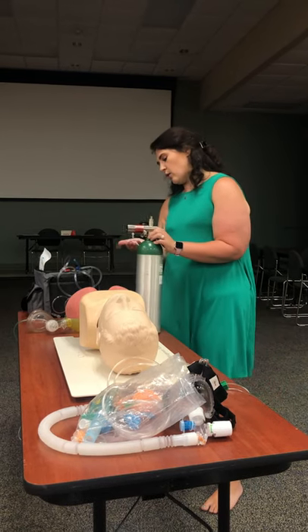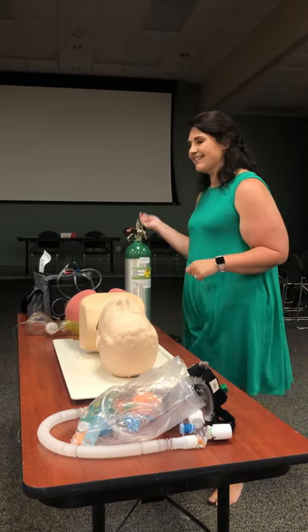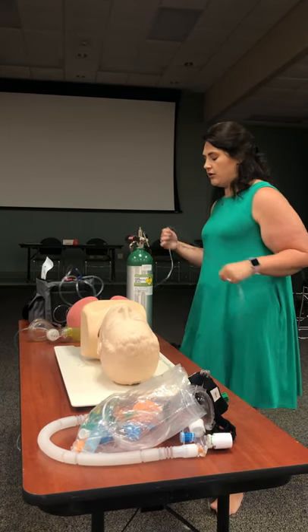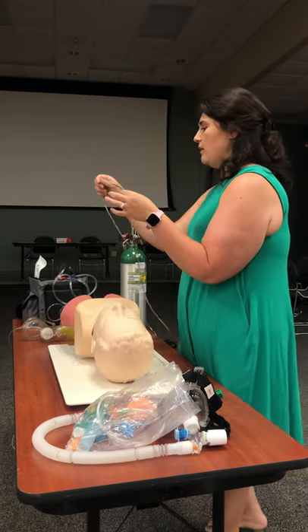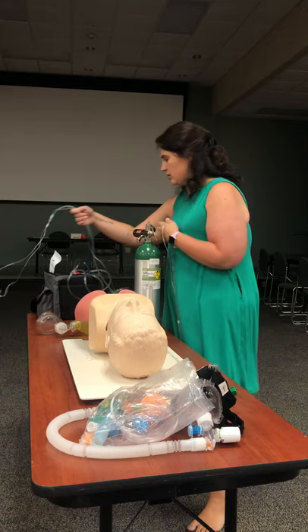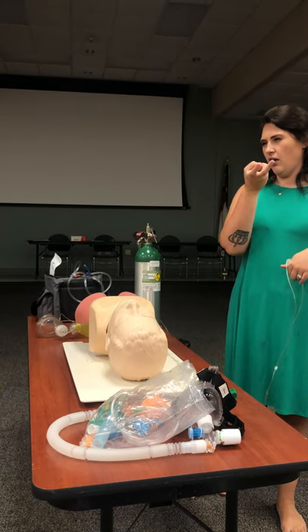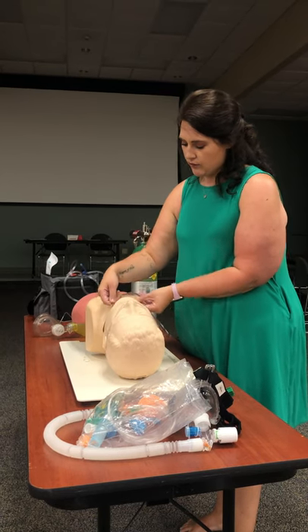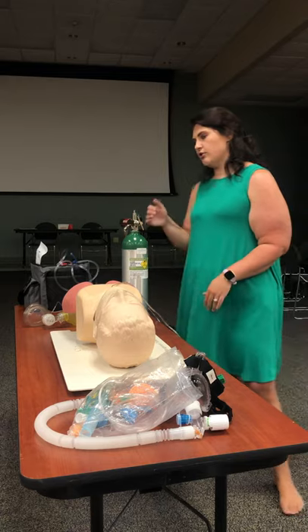I'll attach my oxygen tubing here. For the nasal cannula I'll set it between one and six liters per minute — normally two to four liters. I hook it up and turn it to two liters. I tell the patient, 'I'm going to put this oxygen in your nose; it's going to tickle a little bit.' The prongs go directly into the nose from the front — if they're bent, you want them curving down into the nose. I wrap the tubing around his ears and tighten it up underneath his chin, then monitor the patient and oxygen tank.